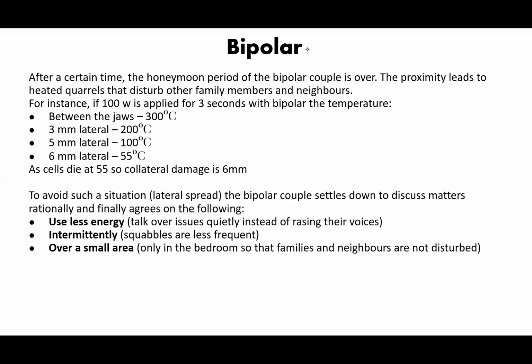Do all your discussion only in the bedroom so that the family and neighbors are not disturbed. Don't pack a lot of tissue and cause serious collateral damage everywhere. So you have to be very careful when using this instrument.